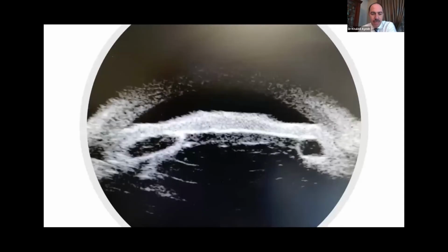So I sent him the patient, and he did a UBM, and we can see how this machine can give us a very good clue and a deep view of this lesion, as we can see in this figure. And we can see that there is also another lesion on the other side of the eye.